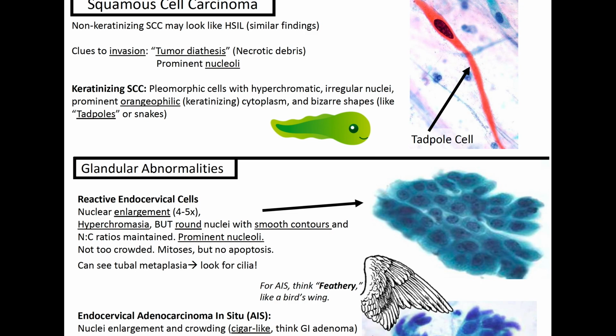Next up, we've got squamous cell carcinoma. I actually just had this on a quiz today and I got it correct.